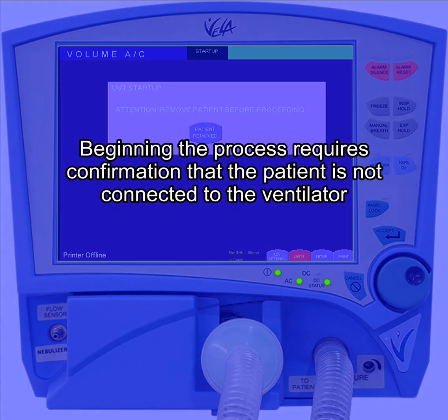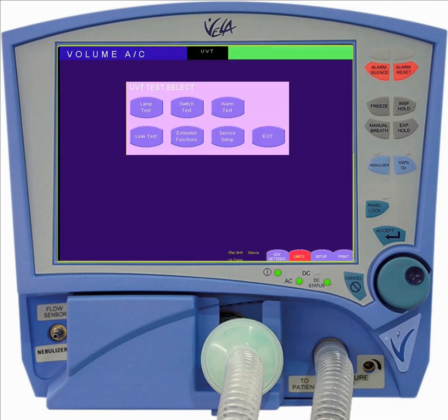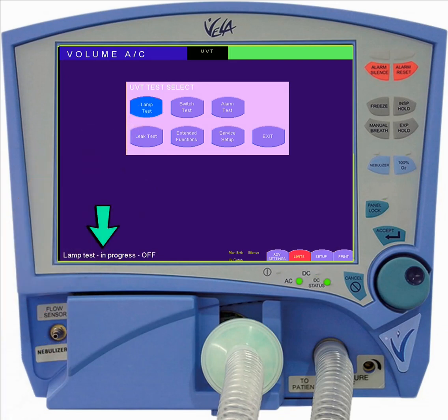Beginning the process requires confirmation that the patient is not connected to the ventilator. Press the patient removed button to move to the next step of the test. The lamp test blinks seven of the LEDs on the front panel of the ventilator so that you can confirm that they are functioning.